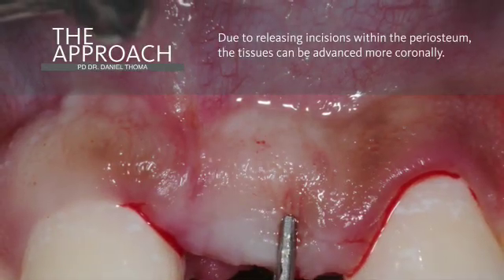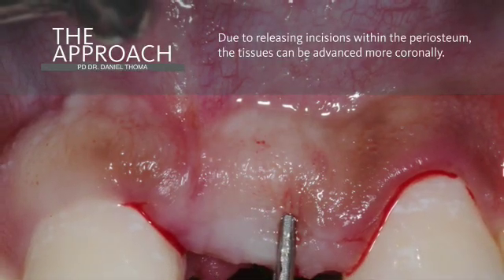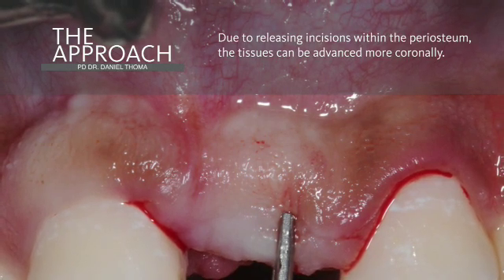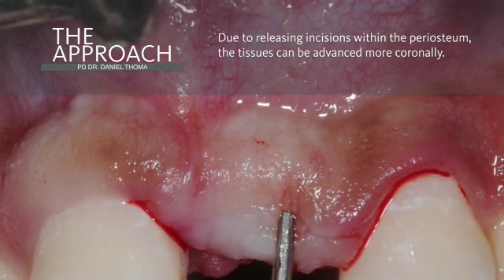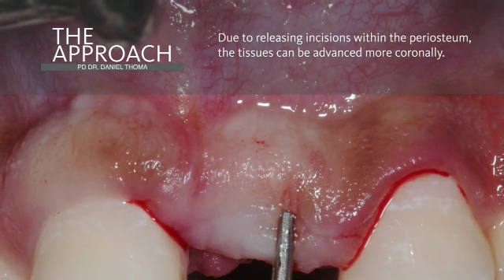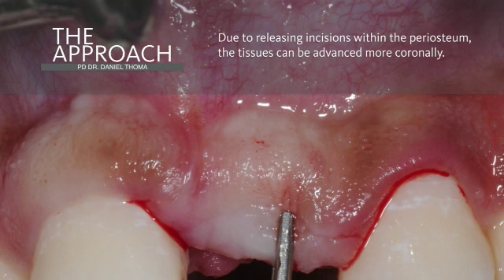Following the preparation of the split-thickness flap, and due to the releasing incision in the periosteum, we are able to advance the flap more coronally.